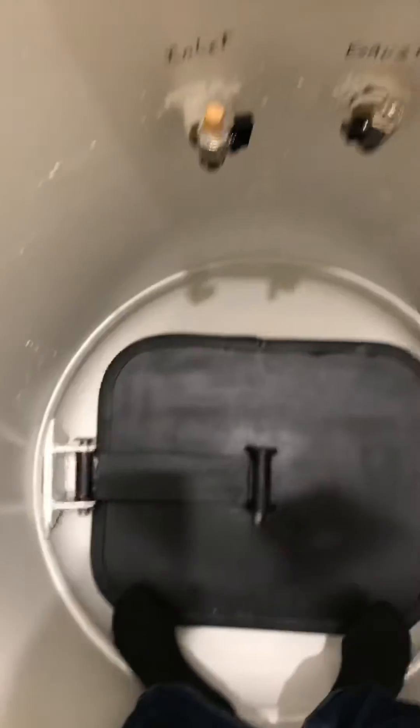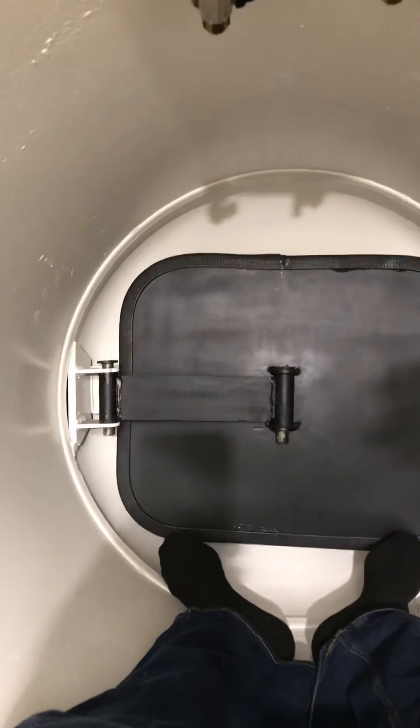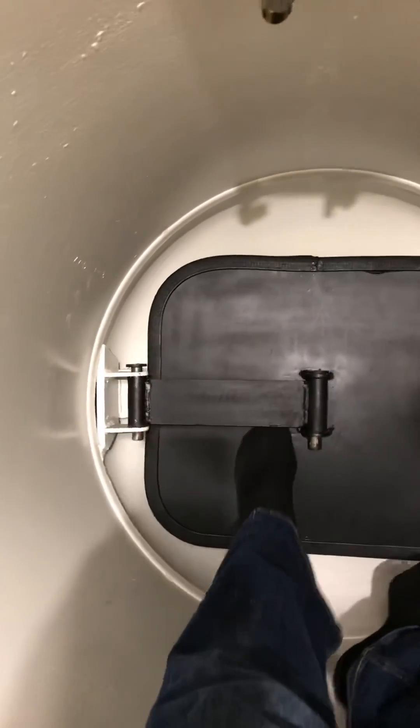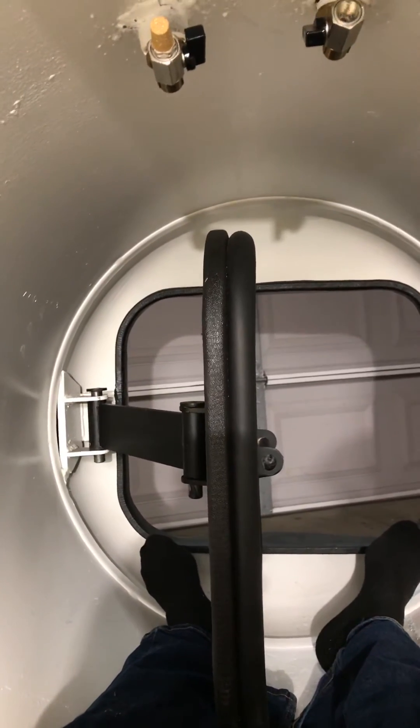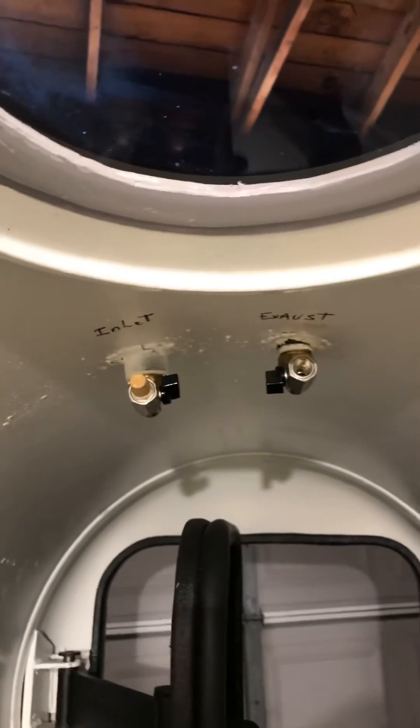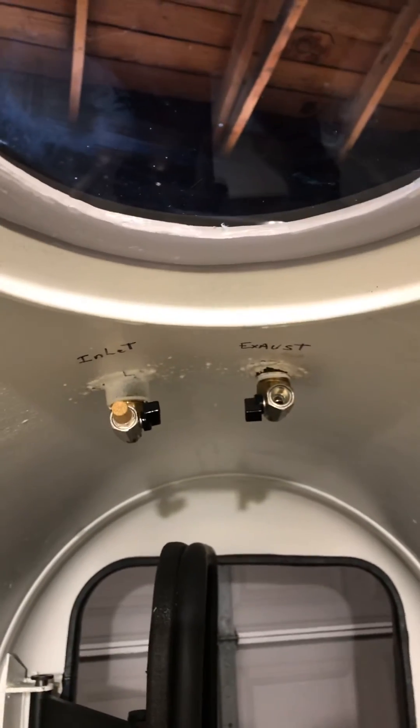You can see the light right there, so it's plenty bright in here. It's been prepared so that it's safe and healthy. There's the door with a double swivel pivot and also a special seal, which is one of the biggest problems people have with these tanks. There's the exhaust and inlet, controlled from the inside.